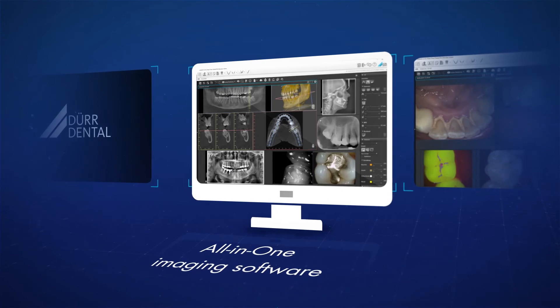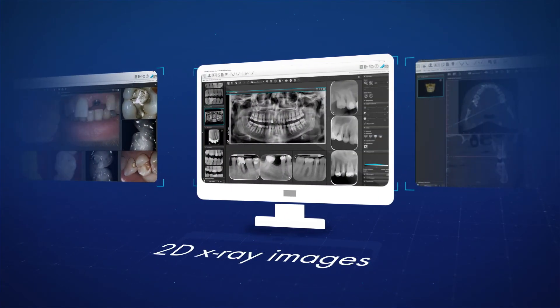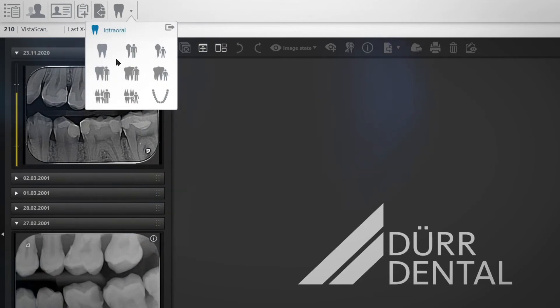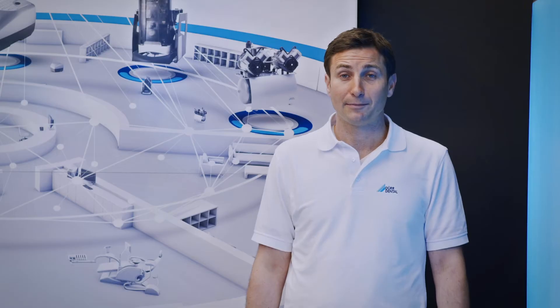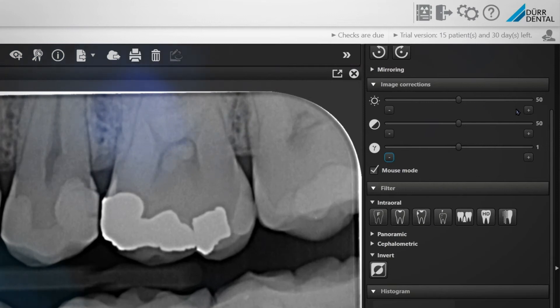VistaSoft, the all-in-one imaging software from DoorDental, can manage all aspects of camera images as well as 2D and 3D x-ray images. Thanks to the modular design and the one-click principle, all the major functions can be accessed with just a single click. Fast and well-conceived workflows guarantee efficient operation and handling. Default image settings can be configured and modified very easily, so images will always be displayed to the user based on their preferred settings.